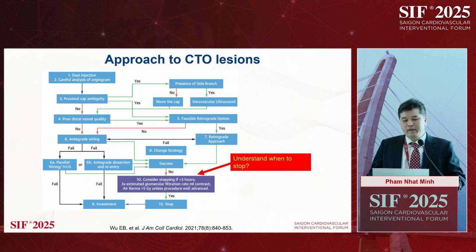We all know about the algorithm to approach a CTO lesion, and maybe the most important thing is that we understand how and when we could stop in the procedure.